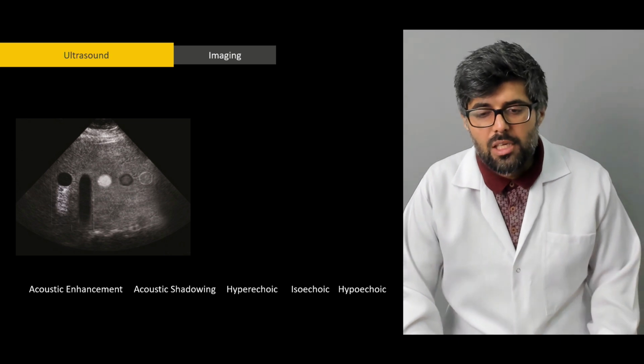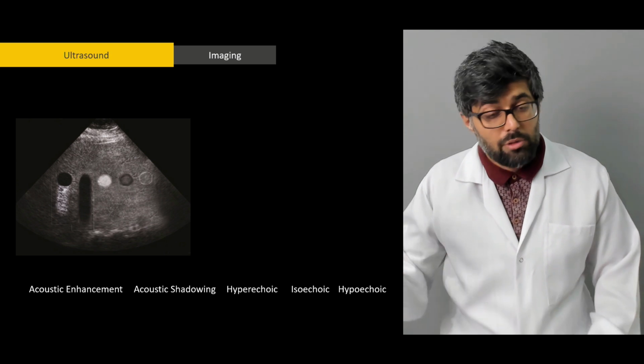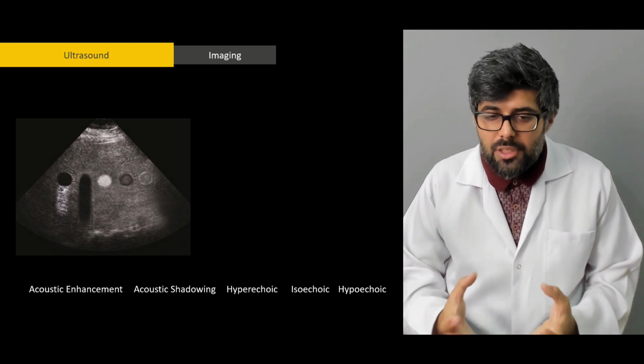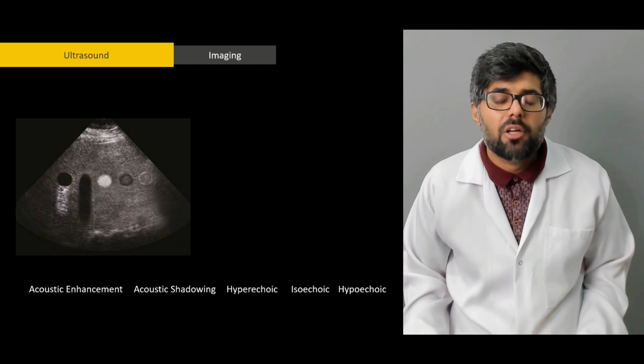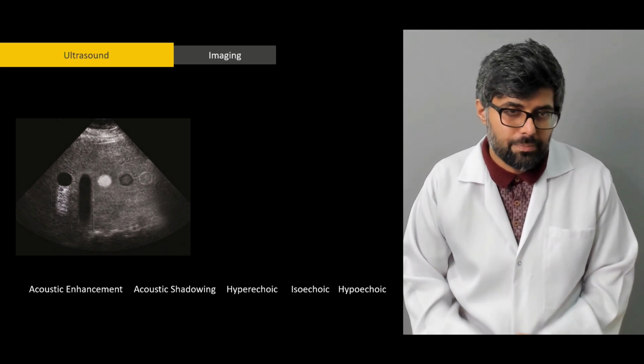Next one is the hypoechoic. Now that cavity on the far right is hardly visible because it is not producing any echo, and that echo is not being read. So it hardly registers on the screen and hardly is read.